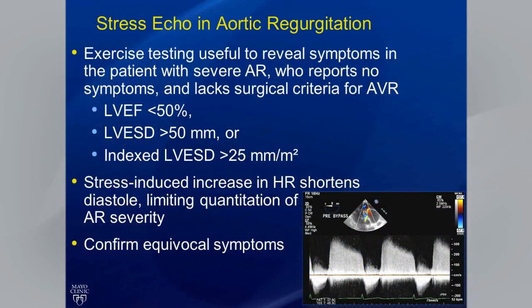What about stress echo in aortic regurgitation? Indeed, there is much less experience applying stress echo to this group of patients. However, it's useful to reveal symptoms in the patient with severe aortic regurgitation who reports no symptoms and lacks surgical criteria for aortic valve replacement, namely an ejection fraction of less than 50%, left ventricular end systolic dimension of greater than 50, or an indexed LVESD of more than 25 millimeters per meter squared.